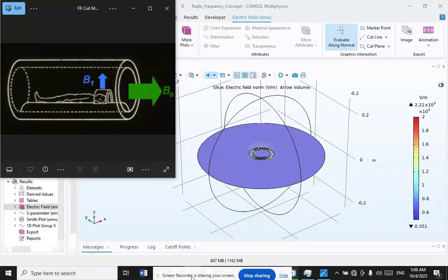The stronger the RF pulse energy, the further the magnetization will tilt or flip, which is called the flip angle, or theta. The RF receive coil, or RX, detects the precessing magnetization, resulting in an induced electric current via electromagnetic induction. The induced current is the MR signal and represents the mixture of magnetization from the tissue within the field of view, or FOV, of the RX coil.